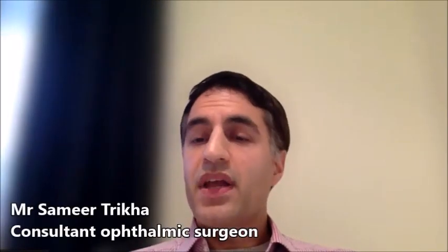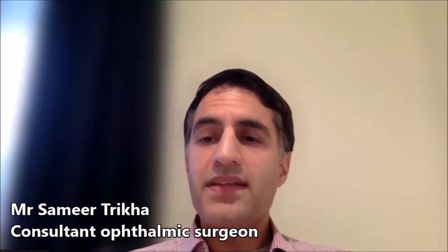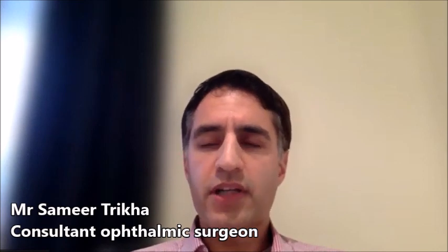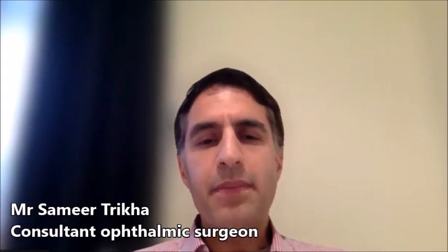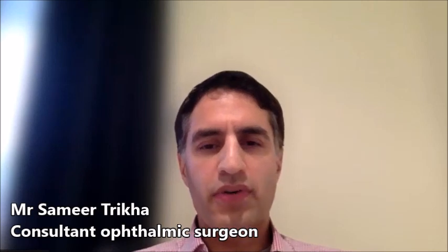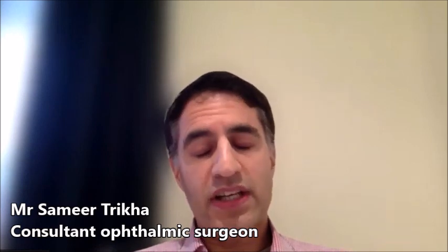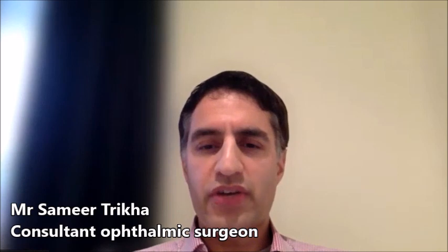Okay, so just a word about the types of lenses and suitability for individual patients. Now, whilst all of these lenses are very safe and have a relatively low side effect profile, they may not be suitable for each and every patient. And I take a very personalized approach to counsel individual patients based on their particular needs, their desires, and also the types of the ocular conditions they may have. For example, glaucoma or macular degeneration.